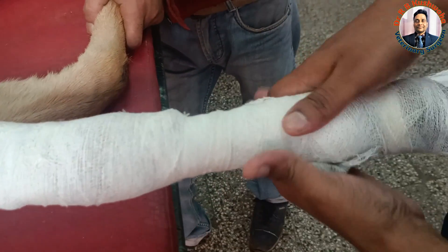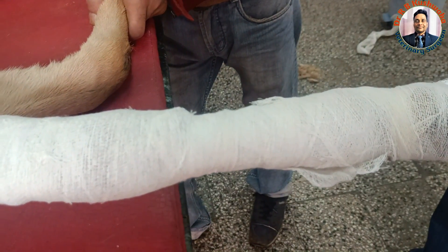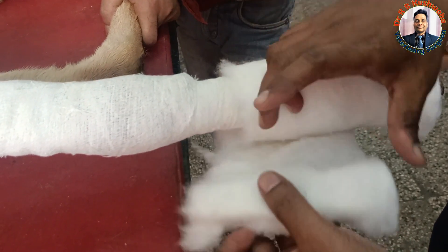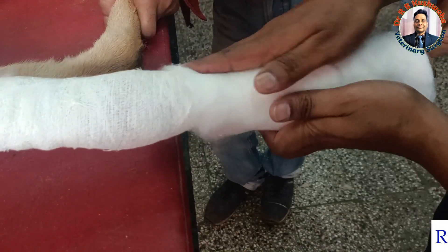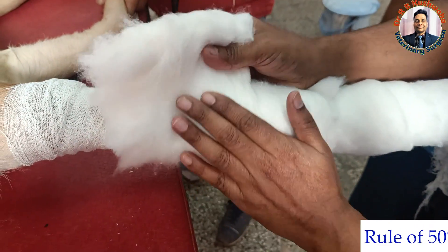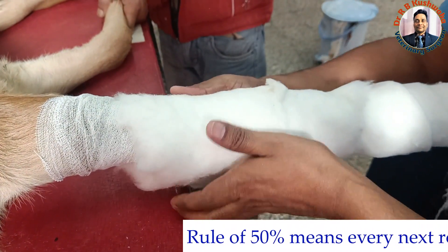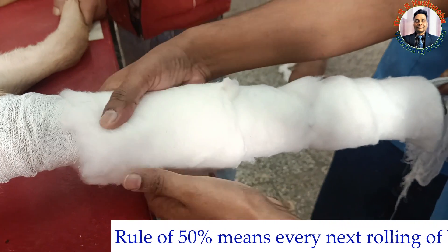Next we go for application of the cotton bandage roll. Whenever we apply a bandage or cotton roll, we follow the rule of 50 — meaning each next layer covers 50 percent of the preceding layer.